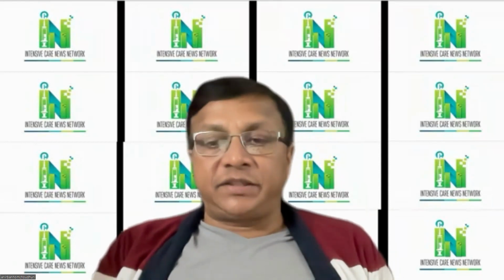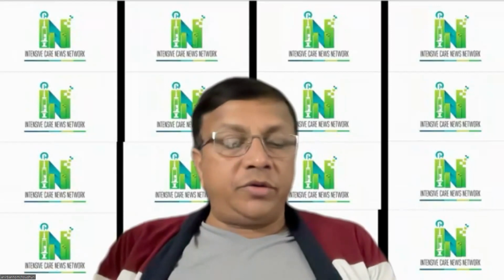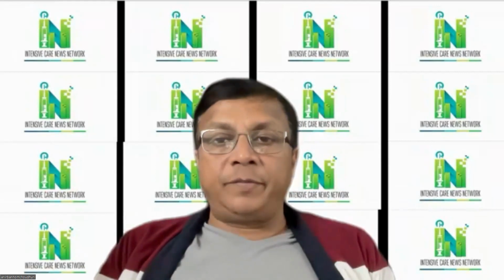Are there any other questions? I think the way we prescribe our medicine only based on weight, it is a very primitive way to prescribe. I think using a body composition monitor to exactly know how much is fat and how much is water, and how to adjust, how to prescribe medicine will be in the future. Dr. Bisman is there. Any comment from Dr. Bisman? Any others can also ask. There are other attendees. So anybody can unmute yourself and ask any queries or any comments if you would like to make, or enlighten on some things which have not been covered.